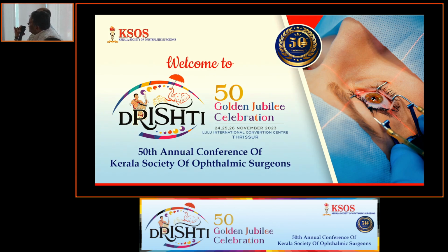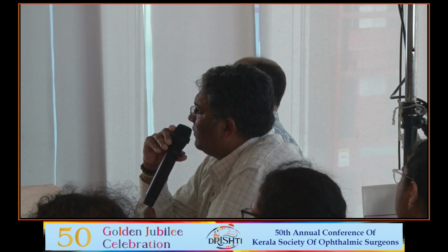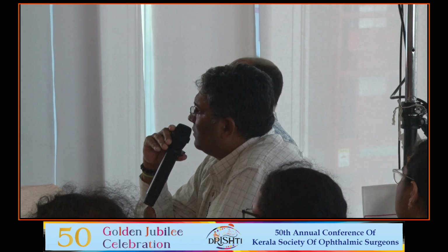The second thing is you use this wide angle. The things that you mentioned, the list that you mentioned, you can pick up in your 20D and 90D also, right? So what is the additional information that you're getting from this gadget that you use? This is non-mydriatic, and there is also a fast acquisition of images, and also we can store the data and it can be transferred. And also these can be sequential fundus imaging, but the treatment response can be assessed using the ultra-wide field images.